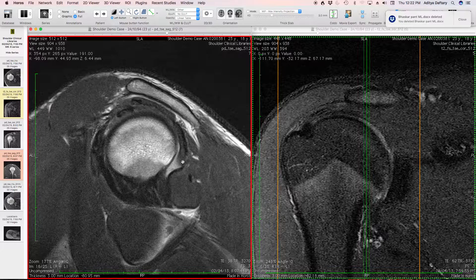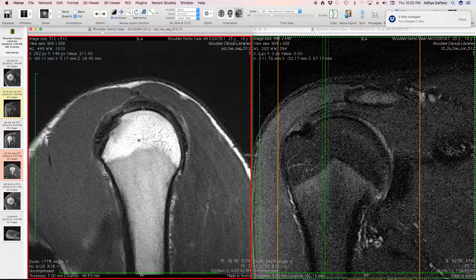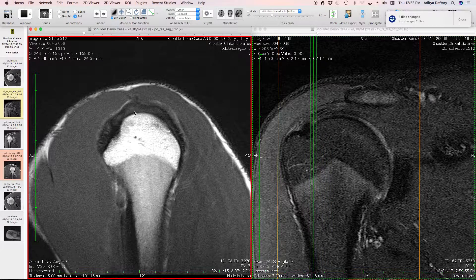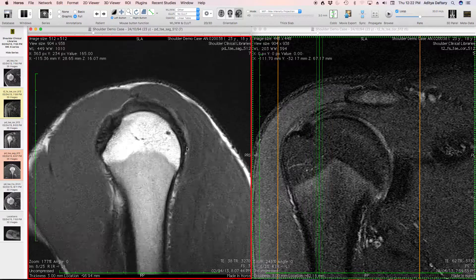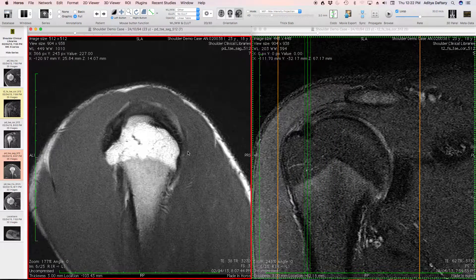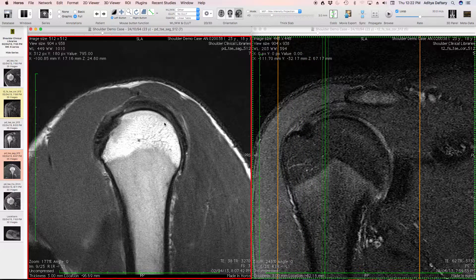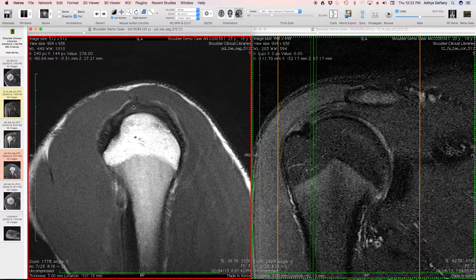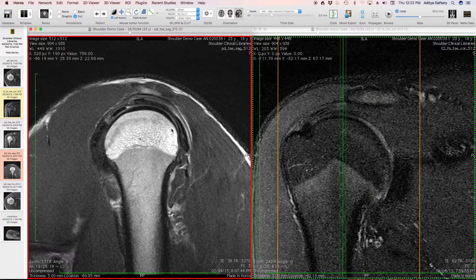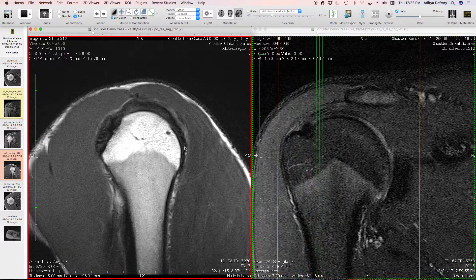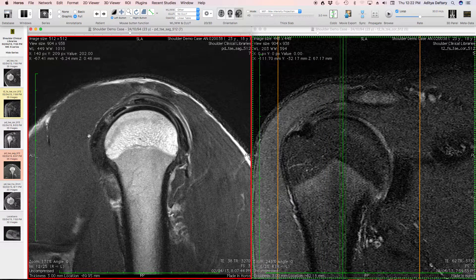Moving on to the infraspinatus — while it's interesting to look at on coronal images, the sagittal images can be quite satisfying, watching the tendon and muscle come across to their humeral attachments. We can see supraspinatus tendinosis here. The posterior infraspinatus fibers insert nicely, while the anterior fibers show a little tendinosis. Primarily, there is increased signal in the supraspinatus and anterior infraspinatus. The posterior infraspinatus and teres minor look good.